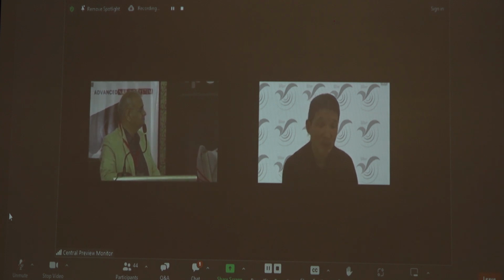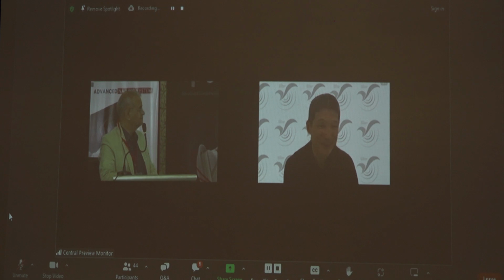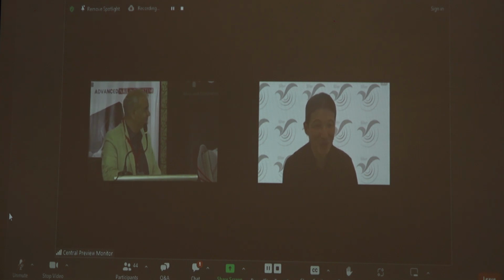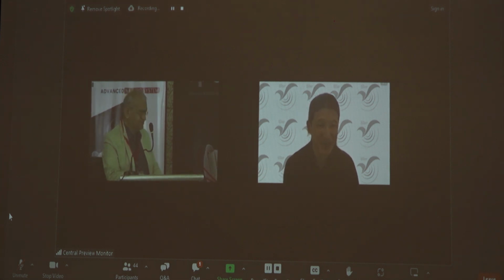So my recommendation is not to go too deep down the bone. I mean, try to avoid penetrating through the joint. I think that's my final message. So I dare not go close to the joint. I always keep more than 5 millimeters, sometimes 10, as my safe zone. So I hope that answers your question.